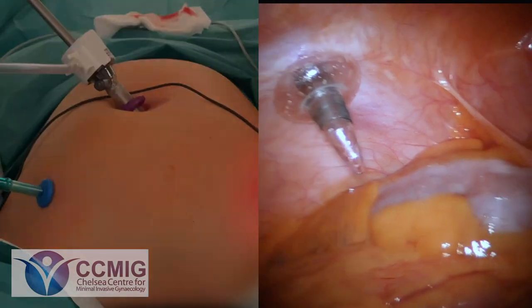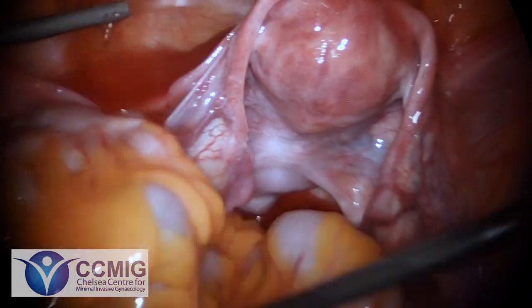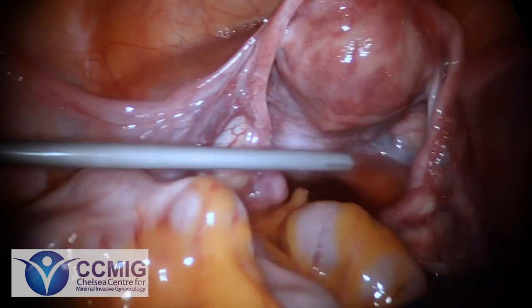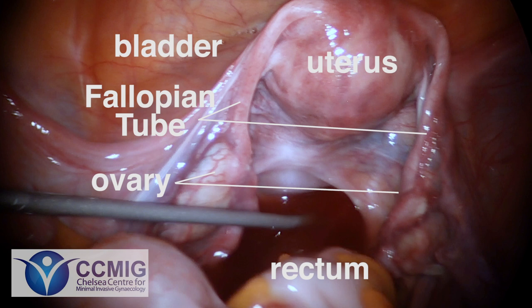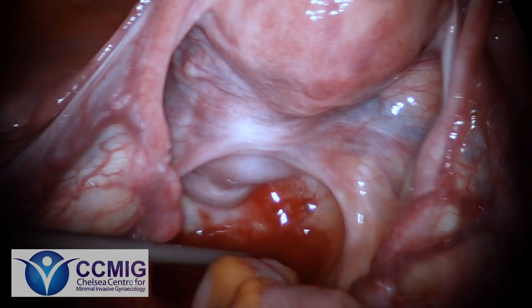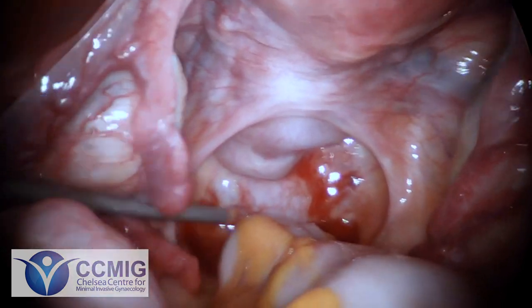So now it's our initial survey. We can see here some structures — we have the uterus in the middle, the bowel at the back, fallopian tubes highlighted on either side. The ovaries are just out of view here behind the fallopian tubes, and at the front on the left hand side we can see the bladder. The rectum lives at the back and in this case it's nice and free and mobile from all the other structures. Occasionally endometriosis actually means these two are very well stuck together.